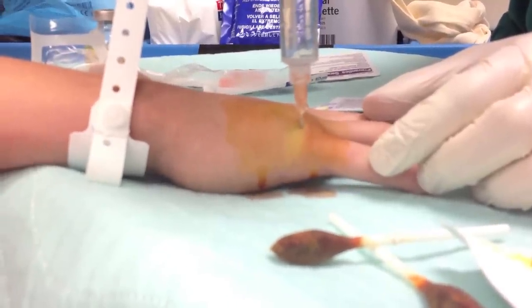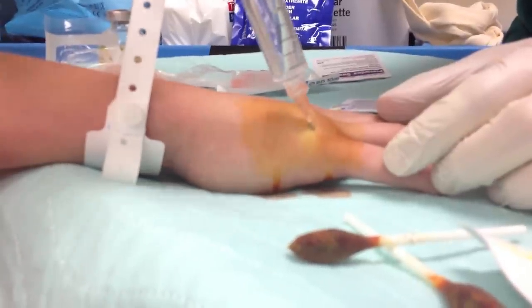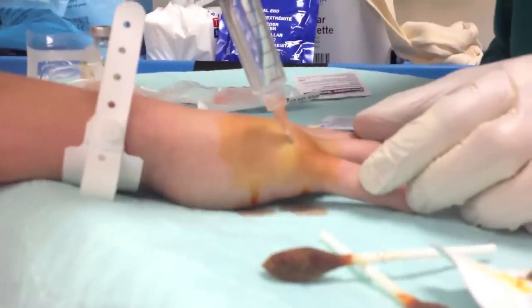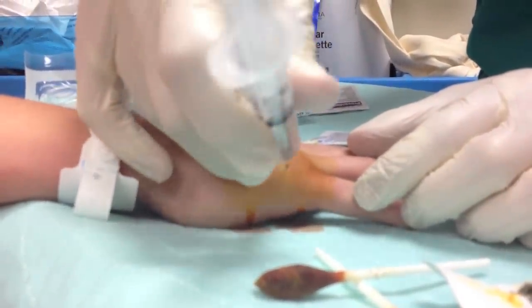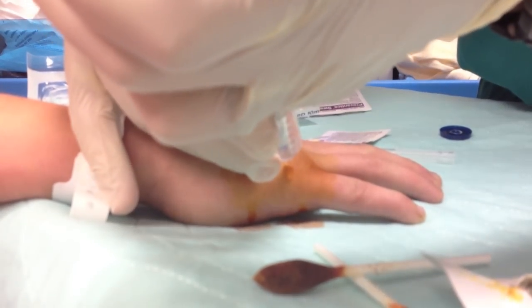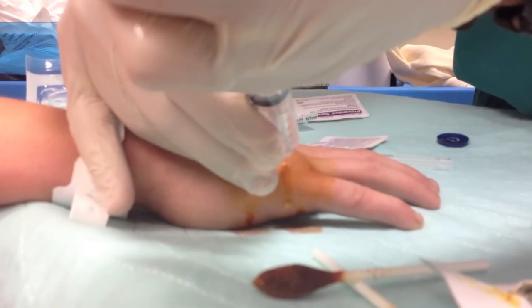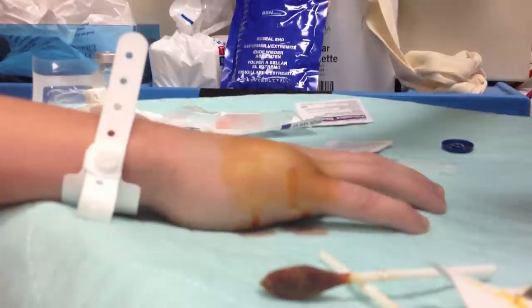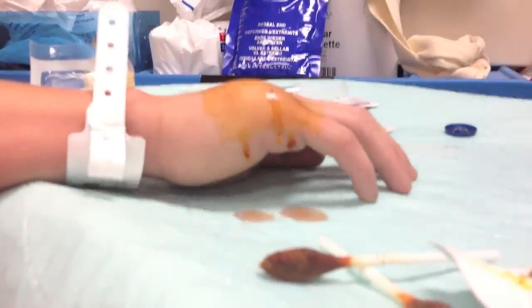Is it starting to get numb? He's doing great — you're doing really good. So we injected about four cc's. I'm just going to stop there, give him about a minute, and we're going to start reducing.